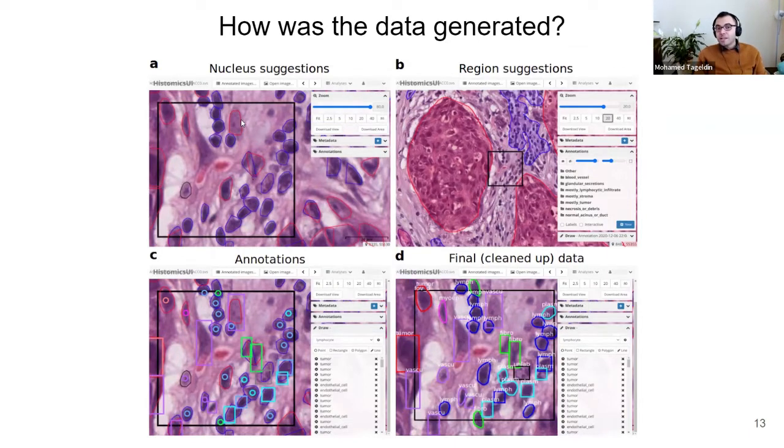Now, we might say this biases the participants in one way or the other, and we actually test for that later, and we show that it's actually not that big of a bias, and it actually improves their classifications more than it biases them in any wrong way. So anyways, this is what the participants were asked to do. This is the background on which they are working, and then if they see something that they like, they just click on it and place a dot. And then the color of the dot is what they think the class is. So it's a very quick process.